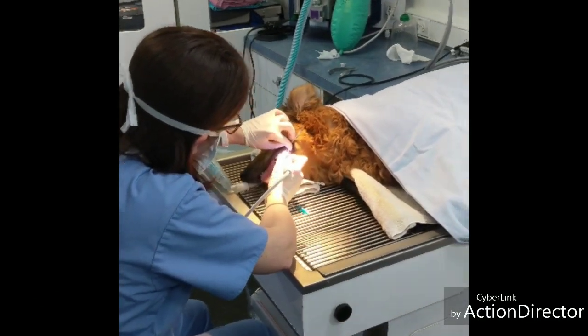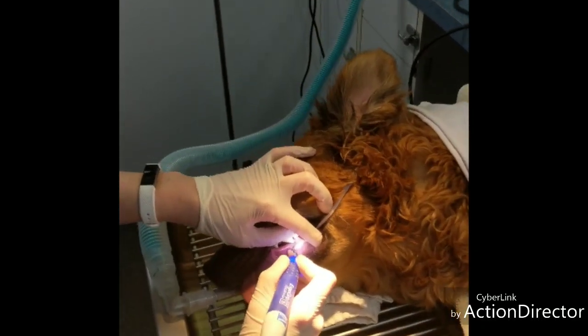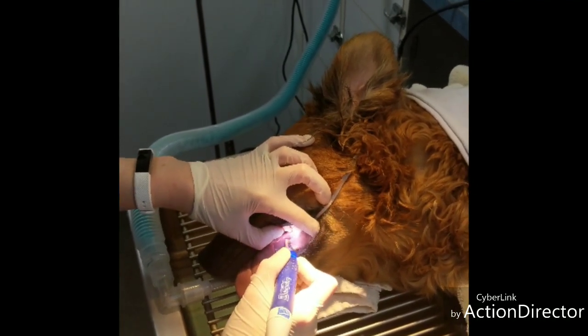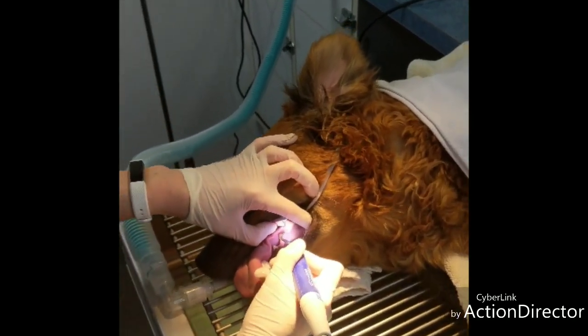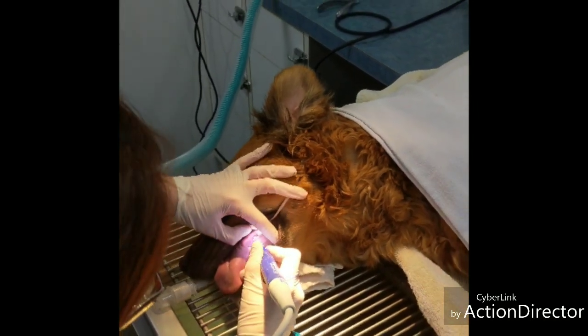We are about midway through Annie's dental cleaning. Leanne is scaling the left side. This is the second side we've worked on. The ultrasonic scaler knocks off the big, thick plaque and tartar, and then we follow that with polishing to make the teeth nice and smooth, which helps prevent further decay. She'll also get a fluoride treatment today.